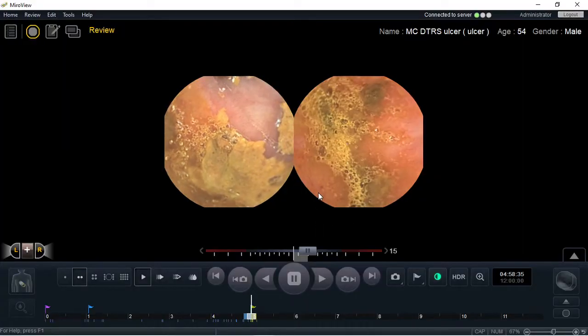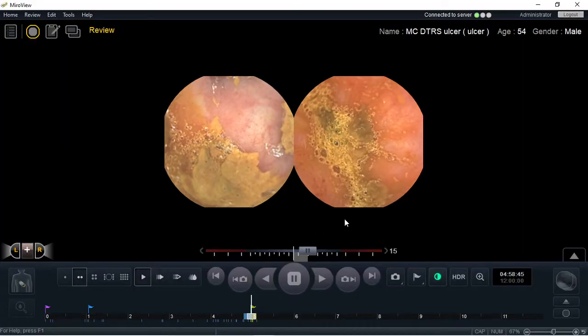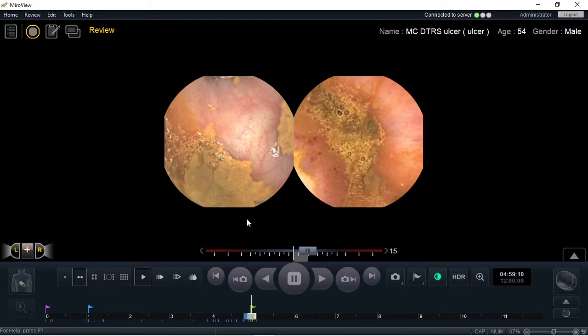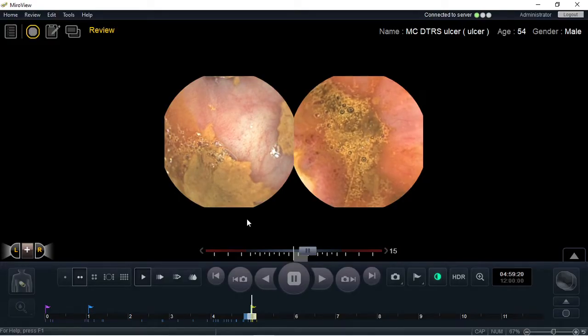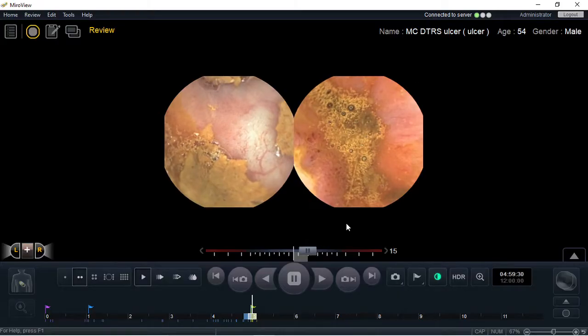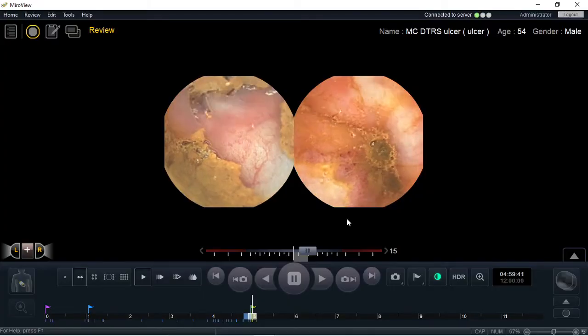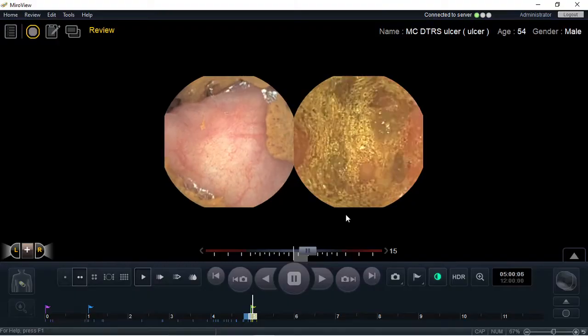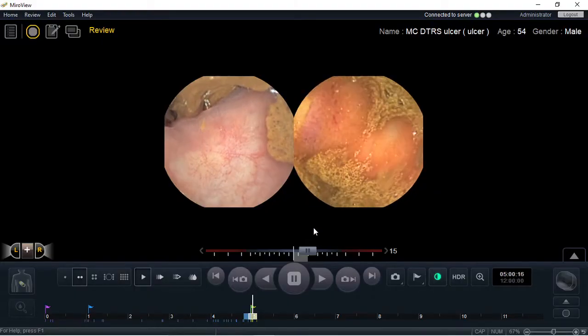If you look carefully here, you will see a large ulcerated area. This is showing you the importance — this report would have been reported as normal, but instead there is a large ulcerated area at the distal ileum. As you can see here, it has just been captured by this area.